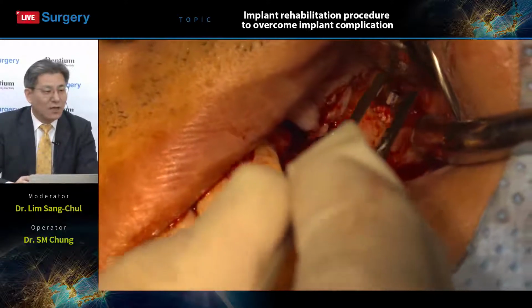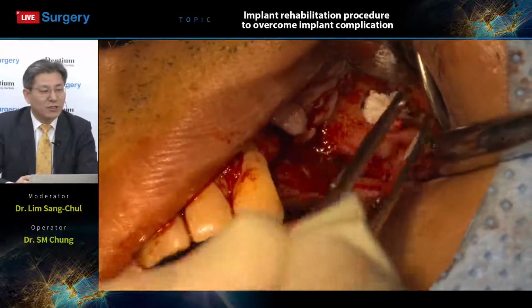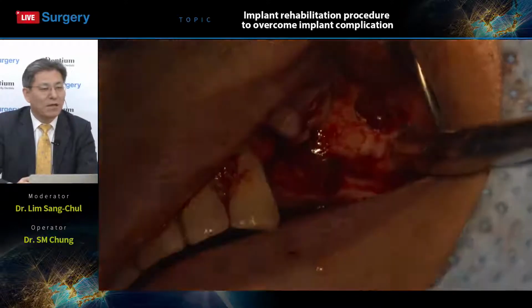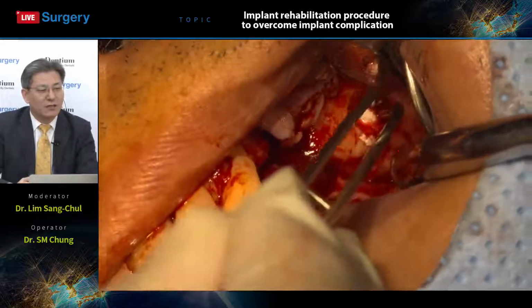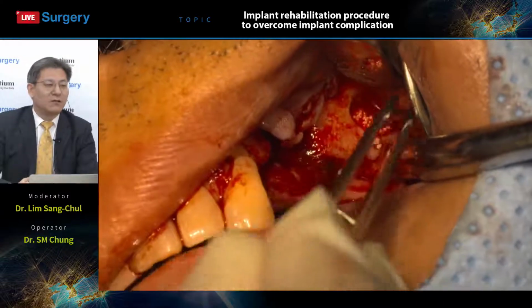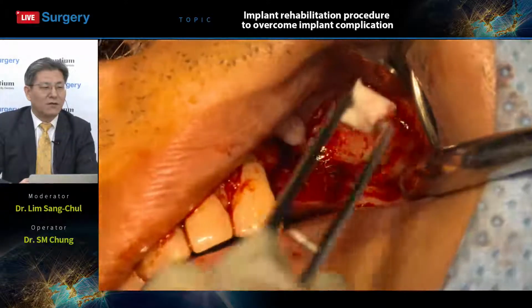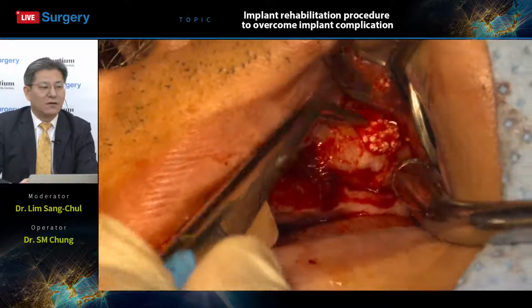Now he puts the Osteon 3 collagen alloplastic graft material into the sinus cavity. Osteon 3 collagen graft materials. So we do the elevation, and also we will place a short implant, the length will be 7 millimeters, but the width will also be 5 millimeters, a very wide and short implant will be placed.